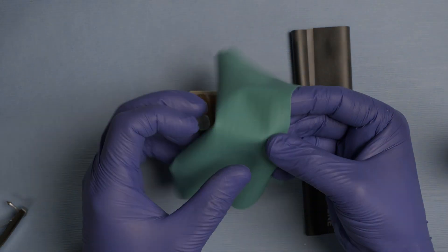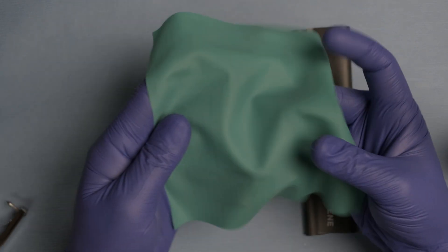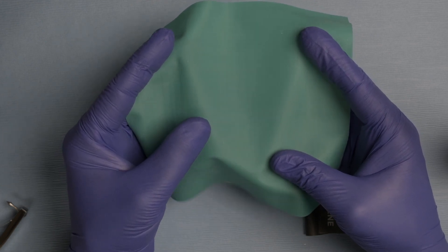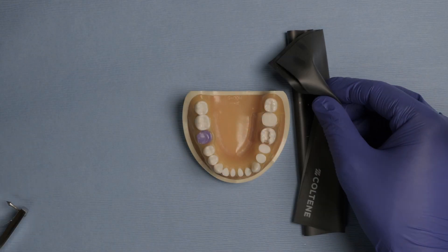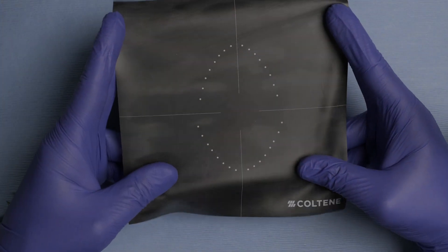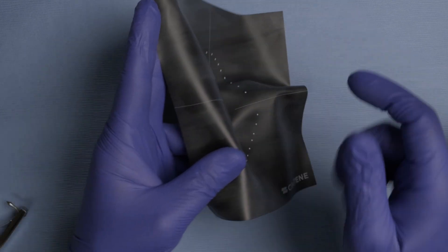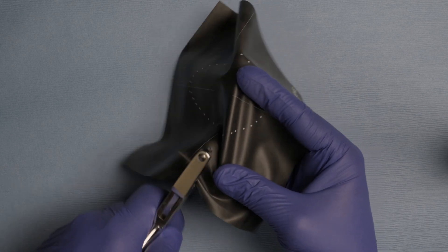When using a regular rubber dam — this is a six by six non-latex rubber dam — you have to guesstimate the distance between each perforation. When I teach other dentists, I always tell them to allow 10 to 15 millimeters between perforations when teeth are missing. For the clinical example, I'm going to use the black Hysolite rubber dam. One of the things I like about this rubber dam is that it's pre-printed, so we know exactly where our perforations need to be and exactly which dots not to perforate when teeth are missing. This takes all the guesswork away and makes it a lot more simple and faster.